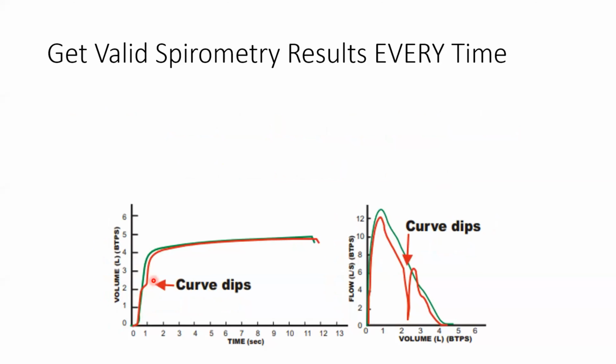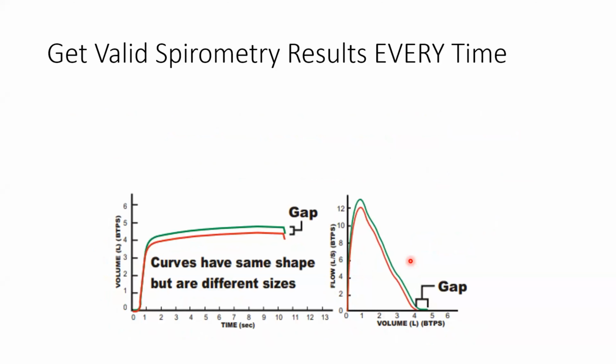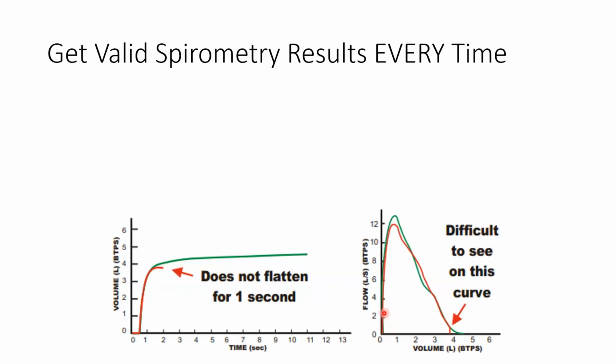This has curves, dips. What's happening here? Cough in the first second. Try giving them a drink. Sometimes water will help. Gaps between the different ones in the overlay. Incomplete inhalation before they blasted. Take a deeper breath before you blast. Make sure you're full.